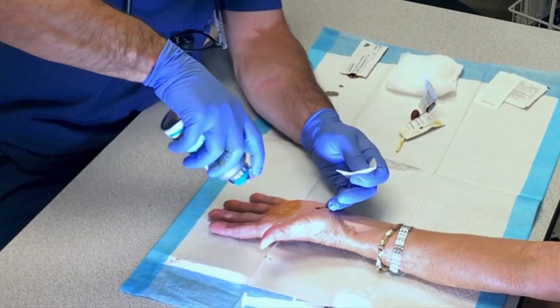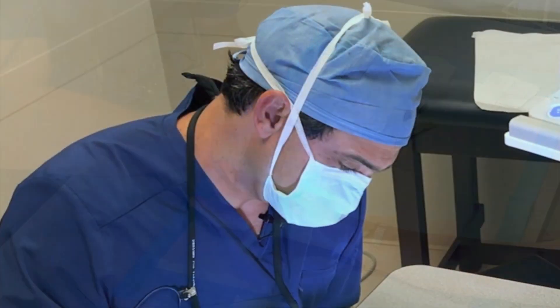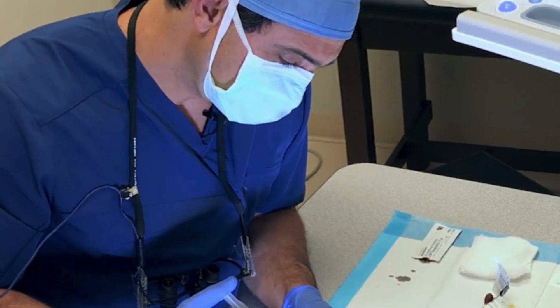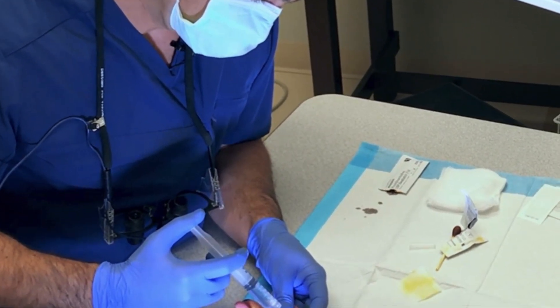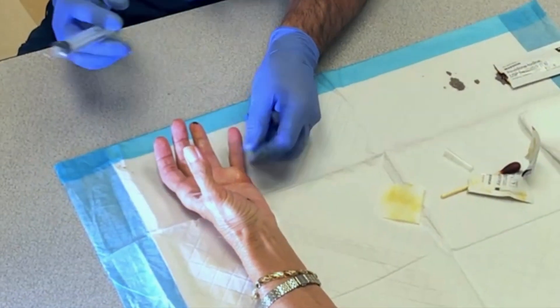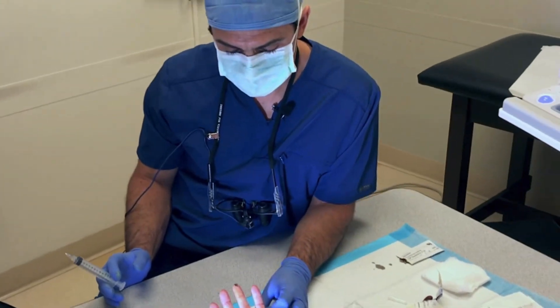I'll spray some cold medication here to numb the skin. Are you doing okay? Yeah. So usually I give a little break after I do the first poke, and then I inject just a little bit under the skin. So now we have all this fluid on the skin, on the hand.